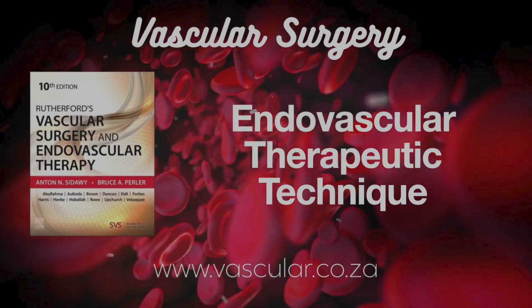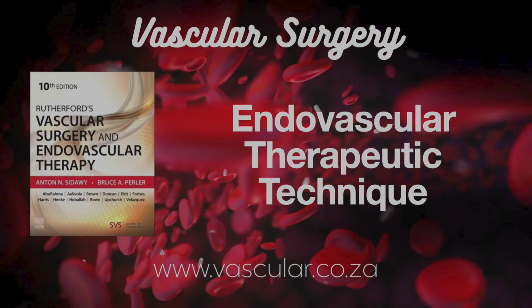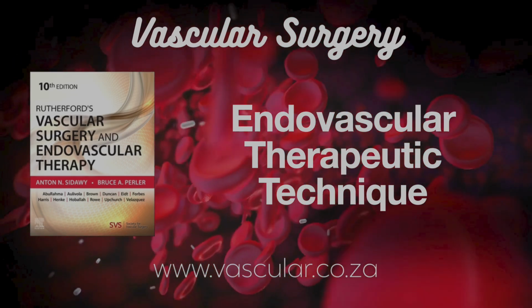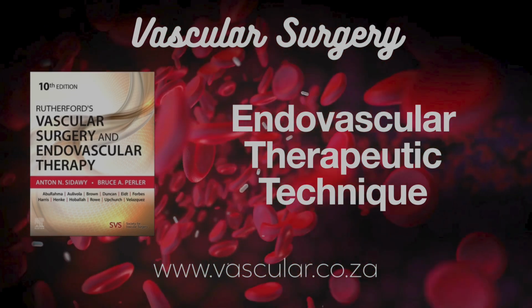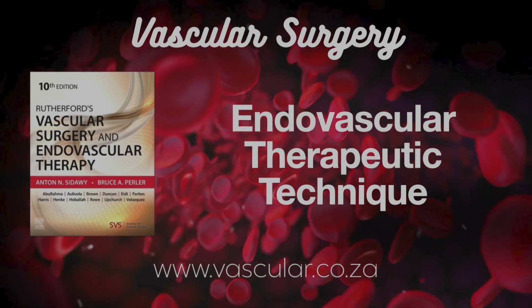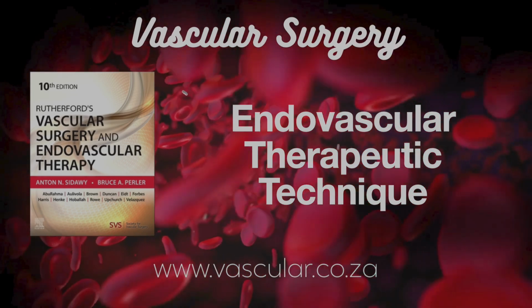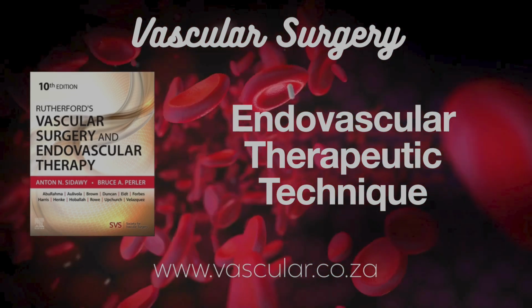Let's pivot now to another important tool set, atherectomy devices. These actually remove plaque, right? When are they used? Exactly. Atherectomy physically removes atherosclerotic plaque. It's useful in a few key scenarios. One is debulking really heavy, calcified, or fibrotic lesions before angioplasty or stenting. The idea is to make those subsequent steps work better. Better immediate result, maybe longer lasting.